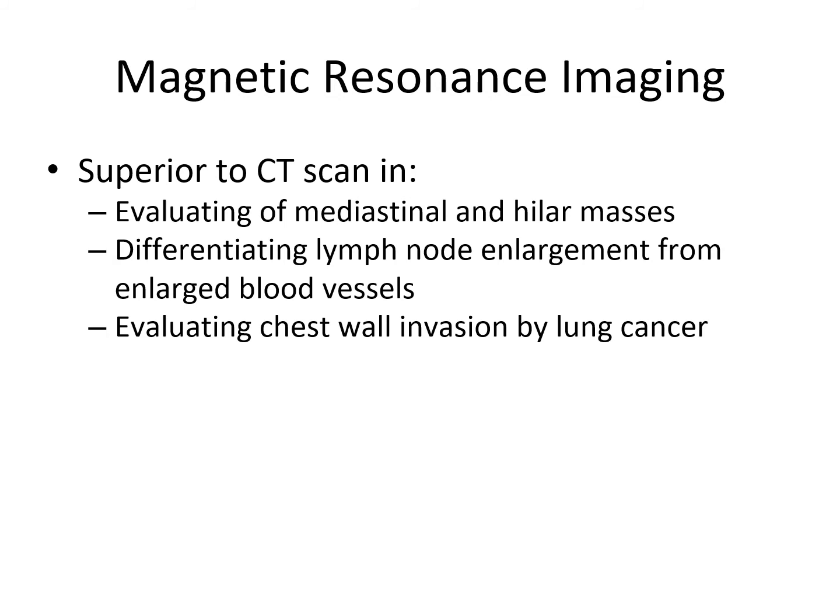But getting them into the MRI room is quite the ordeal, because we have to switch everything so that nothing is being attracted to the magnet. So it has to be MRI compatible. You have to look for any metals. They have to do a really complete assessment of the patient to make sure they don't have any metal implants. They have to change all their monitoring leads, their IVs, IV poles. We have to change them to a different ventilator.